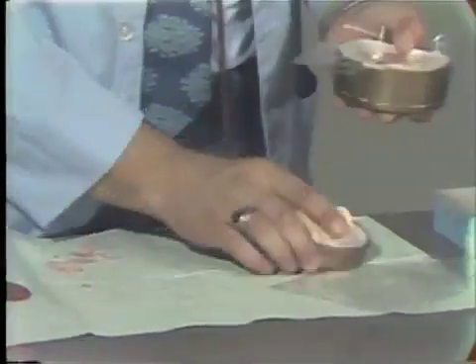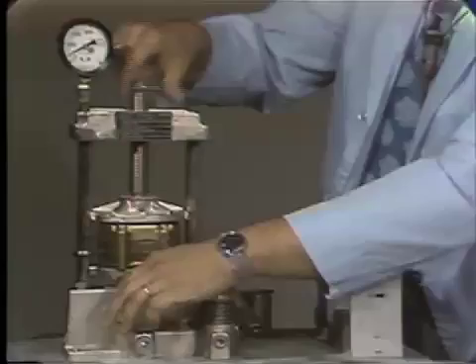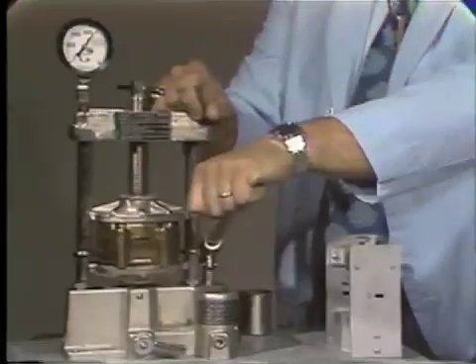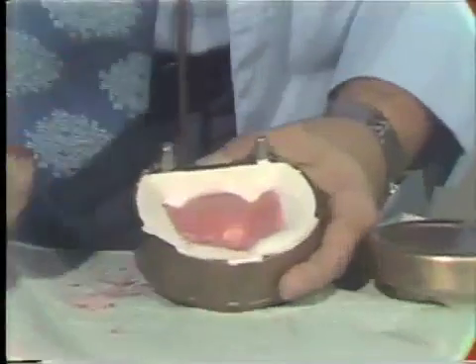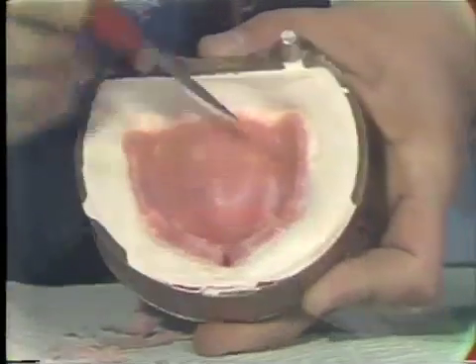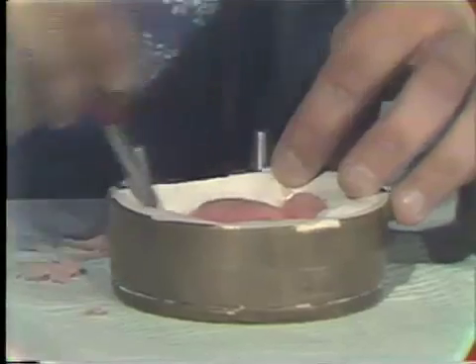Again we will place a polystyrene sheet, place our flask together, and pack it — this will probably be the last time. We release the pressure and retrieve it. This time if you come in close you will notice that we are getting very, very little flash: a slight bit around the posterior of the denture and a little bit along the left buccal flange. At this point I am quite certain that I have got adequate closure of the flask. I will remove the flash that is present.